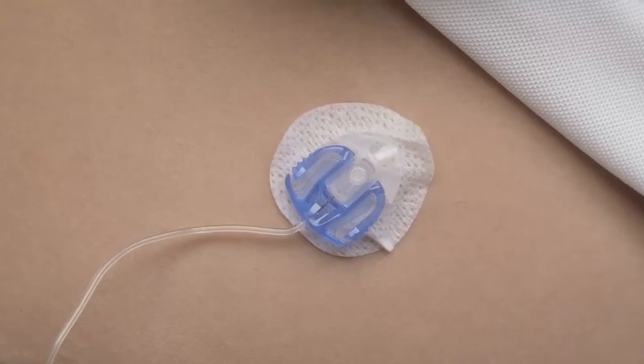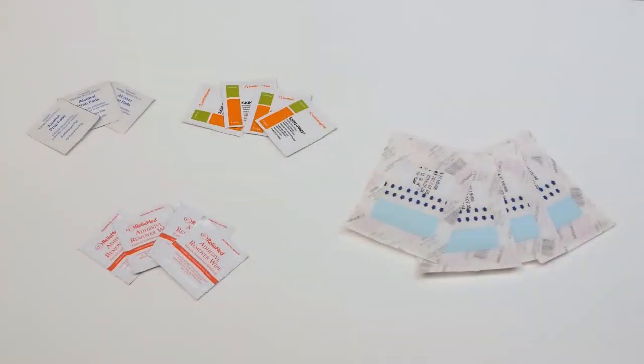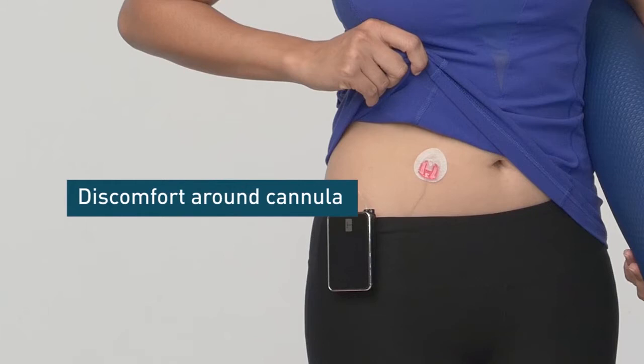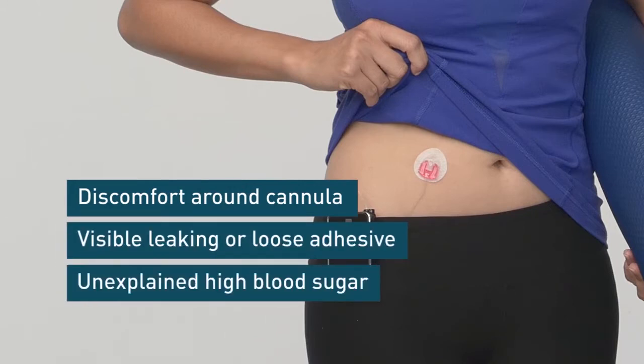Whatever the reason, having a set fall off is extremely inconvenient and potentially dangerous, so it's important to have some strategies for keeping them in place. Some of the signs that you're having an issue with your infusion set are discomfort around the cannula, visible leaking or loose adhesive, or if you have experienced a high blood sugar despite correction with your pump.